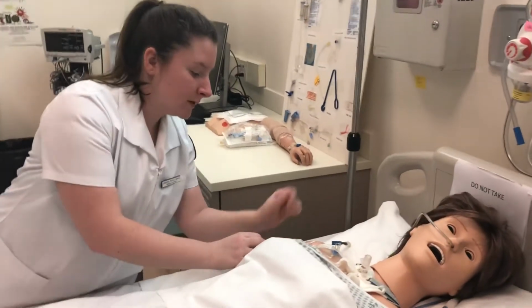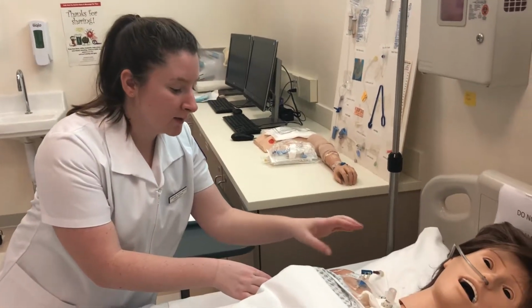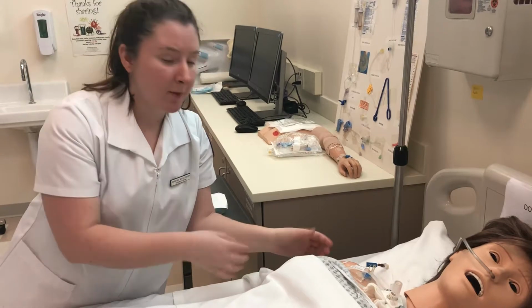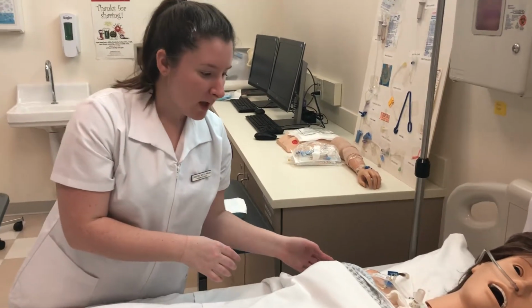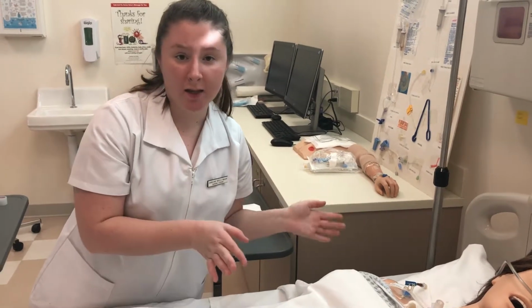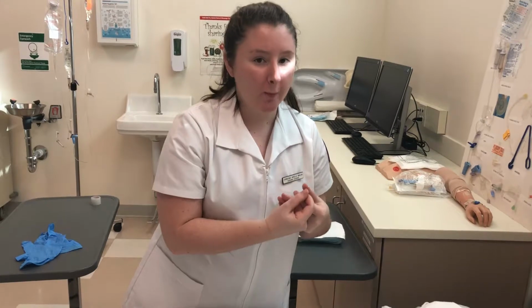And before I take the old dressing off, I'm going to look at it and assess for any redness, irritation. I'm going to ask the patient if they're in any pain or if it's irritating them. And then I'm going to ask them before I start anything to not touch the wound site because I don't want them to interfere with what I'm doing.